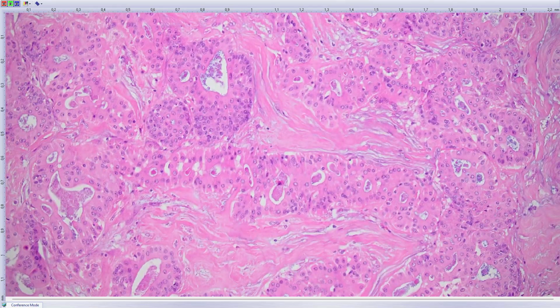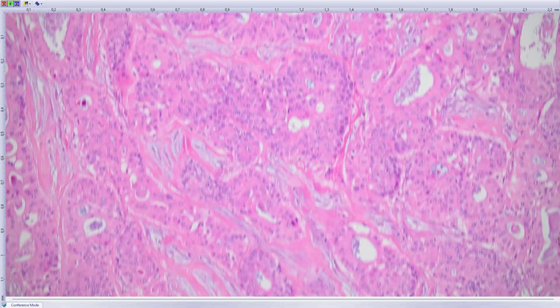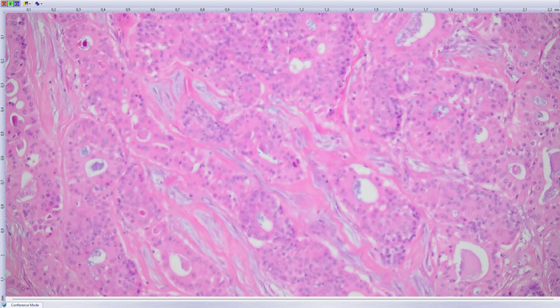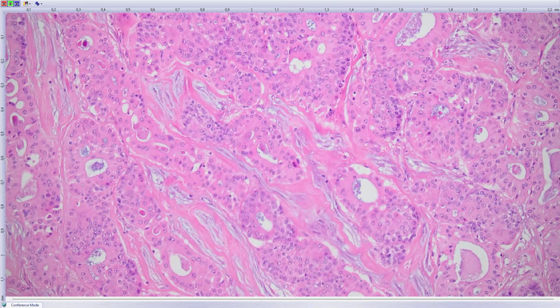So we performed... Secretory carcinoma? Yeah, secretory carcinoma, it could be, of course, but it's not. It's not acinic cell. Any other suggestion? Acinic cell carcinoma? Oh no, it does not look like this.